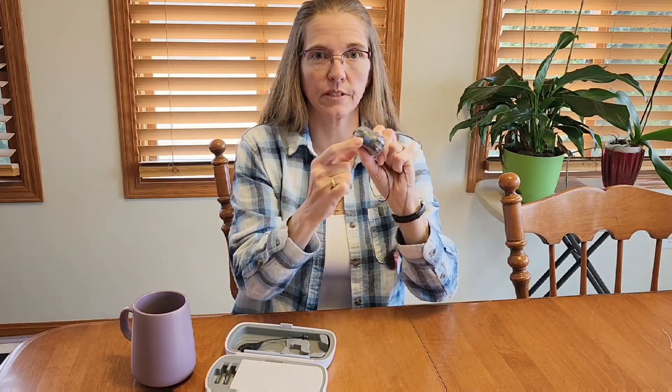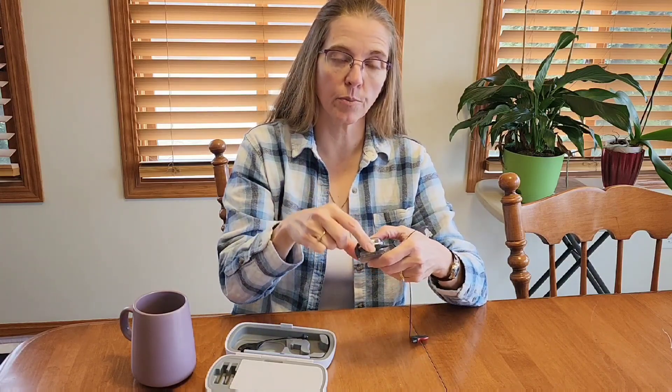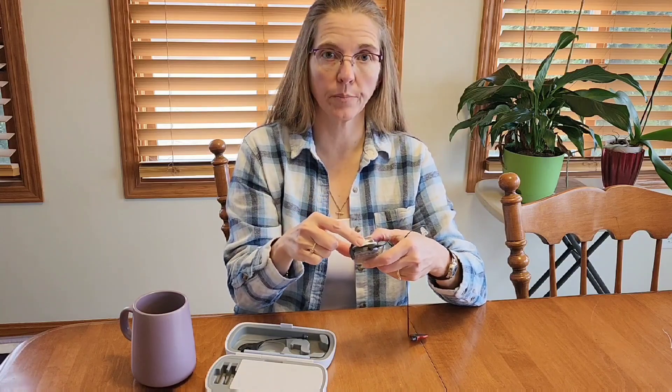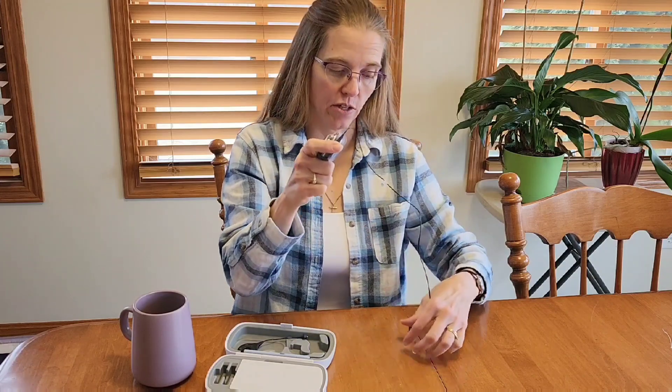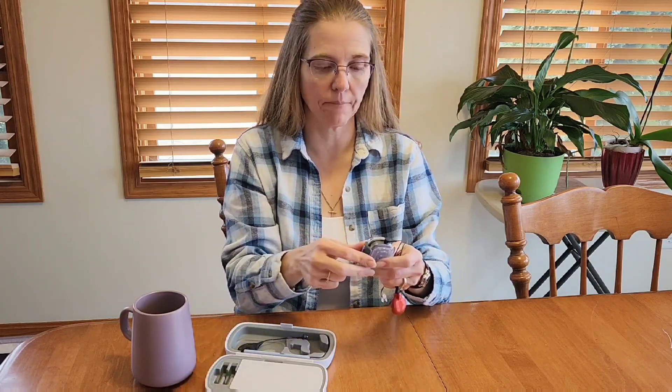So I've got my clip. I can clip it to my shirt or clip it to an armband — that's it. You do want to make sure with your programming that you switch to your off-ear wearing program, otherwise you're going to be hearing the mics inside the case. You want to make sure that you're using the mic that's on the headpiece. It's super easy if you have the app — just launch the app and do that.